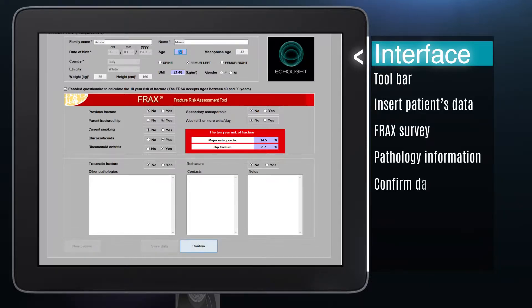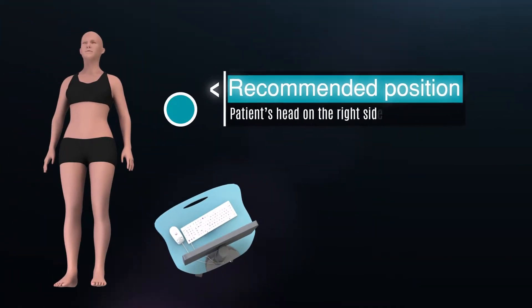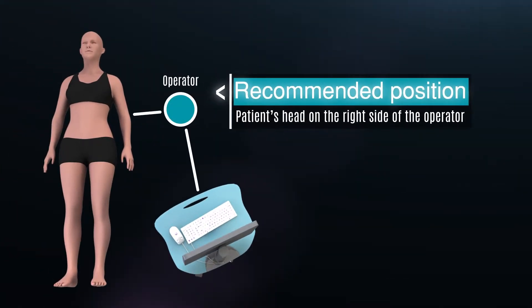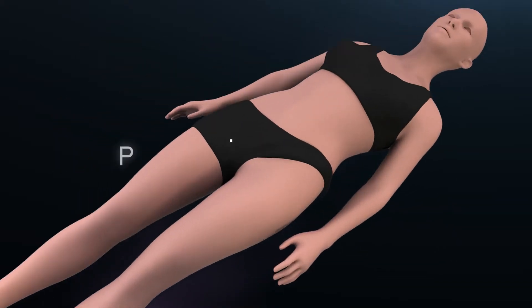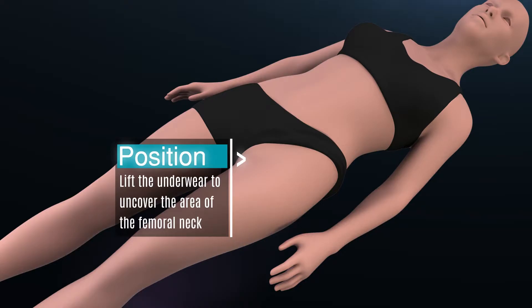Confirm data by clicking on save data and confirm. It is recommended to place or locate the patient with the head on the right of the operator. Lift underwear to uncover the area of the femoral head.